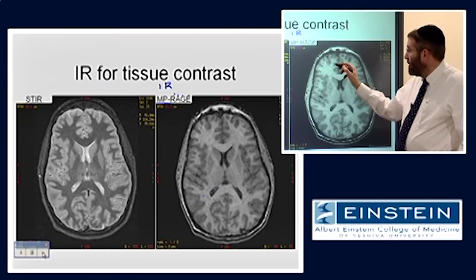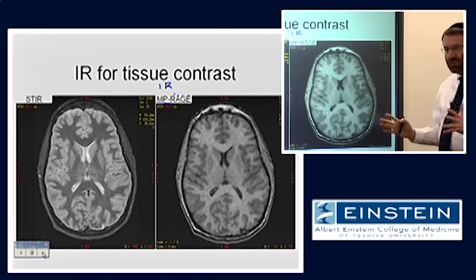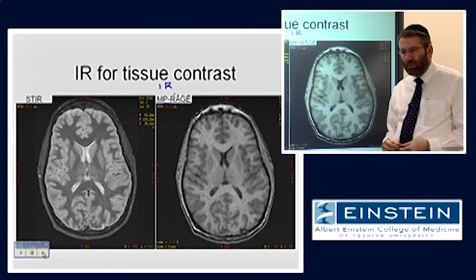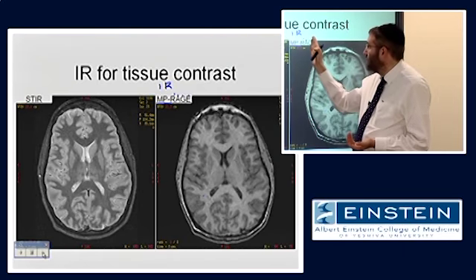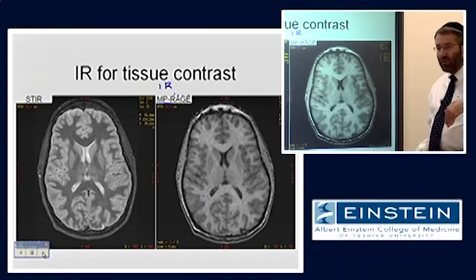So you can actually think of this idea of inversion recovery imaging as not really some pulse sequence that is unique unto itself, but it is a component that we can stick on to the front end of pretty much any other pulse sequence. Whether we're doing gradient echo, spin echo, or other things that we'll talk about later on today, you always have the option of adding inversion recovery simply by placing a 180-degree RF pulse at the front end of your pulse sequence.